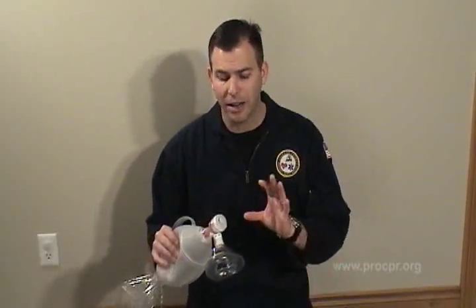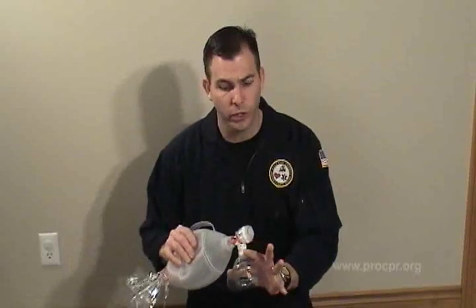Remember that one of the biggest problems we have is thinking we're ventilating the patient, but we don't have a good seal, air is escaping out the side of the face, and if that's happening, we may want to consider going back to a simple mask, rescue breathing, using a one-way valve CPR shield. And I always caution my students about that. If this isn't working for you and you're not in good practice, skip it. Put it to the side, grab a regular one-way valve CPR shield and use that.